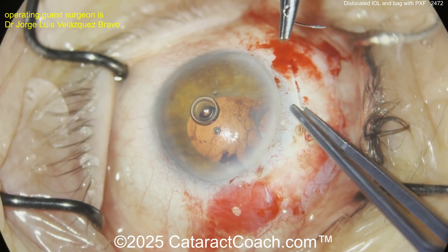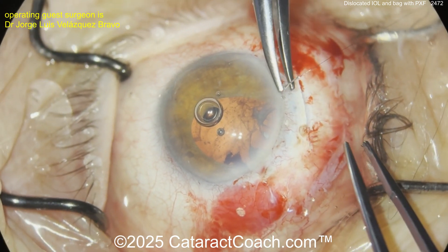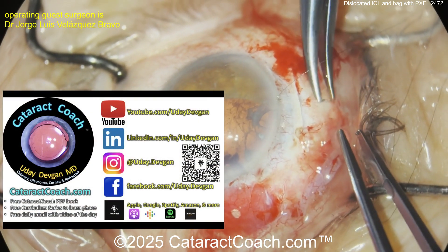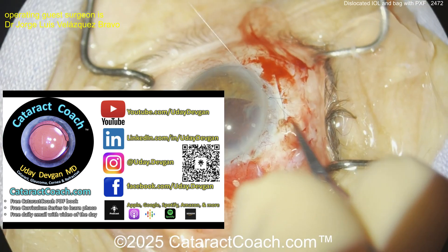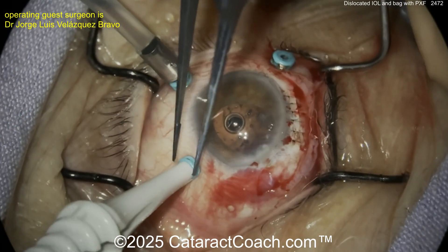Look at that — gone. Now suturing this closed; you're going to need to clean this up. There's obviously going to be some vitreous prolapse as well. Remember, check out our Cataract Coach podcast — the top podcast in all of ophthalmology — we teach you the secrets to being a better, more successful surgeon.